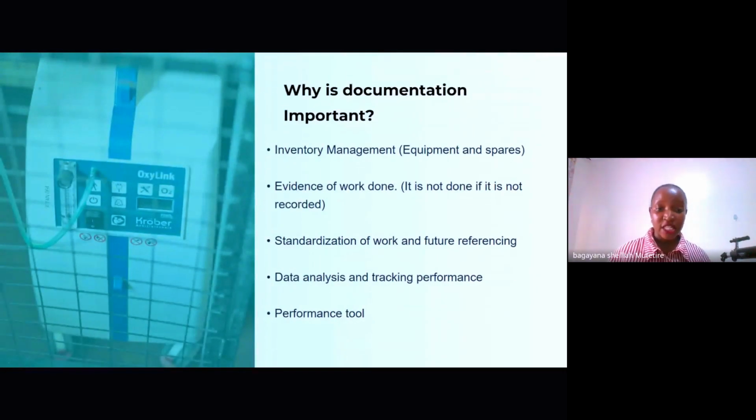So that also leads us to data analysis and tracking performance. So with the data collection, we're able to track performance and know even the facilities that have a higher demand than that have a low demand. We're able to, again, track performance, usage of spare parts, working hours of our staff, and it can also be used as a performance tool.